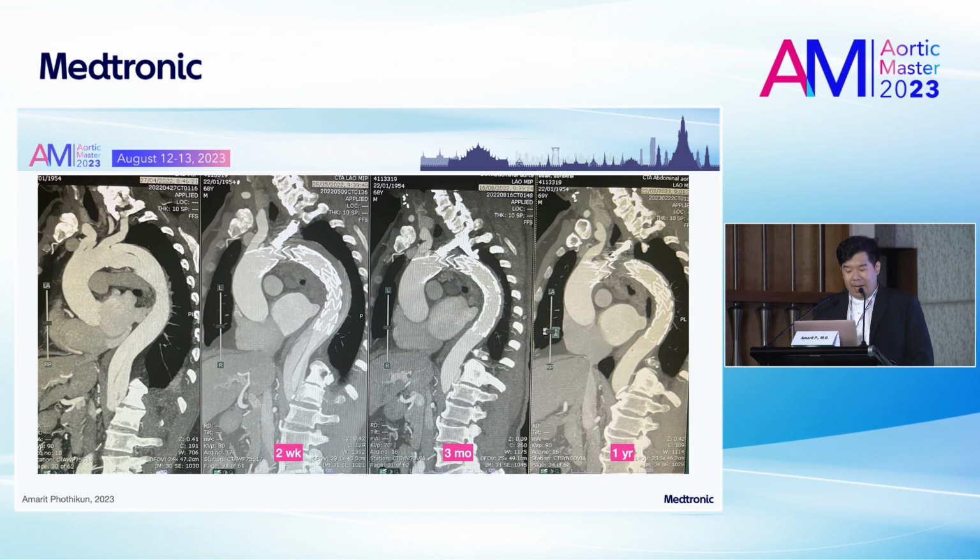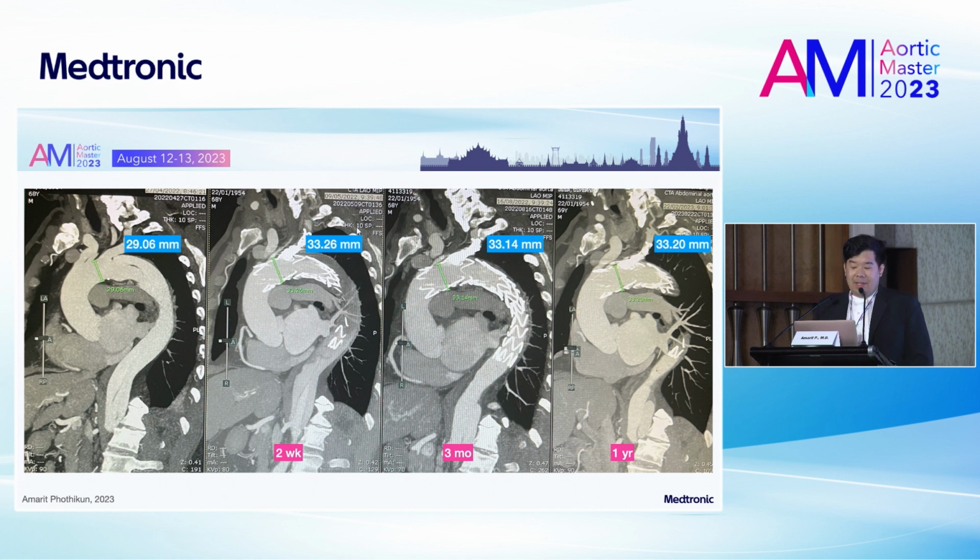After follow-up for this patient, you see that the stent graft and the aortic remodeling are also good, even though he has a saccular aneurysm. When we follow up, the saccular aneurysm is thrombosed, and the residual dissection has not occurred in this case. It's like a complete remodeling of the aorta. When we focus on the aortic arch that has a saccular aneurysm, on follow-up by CT, the size of the aortic arch has not increased in 1 year after follow-up.